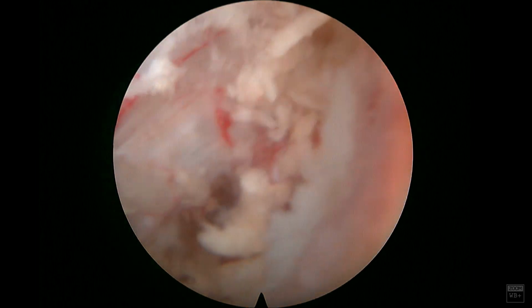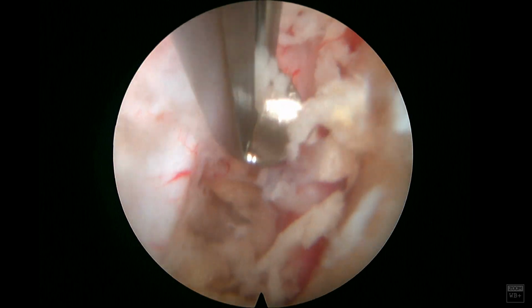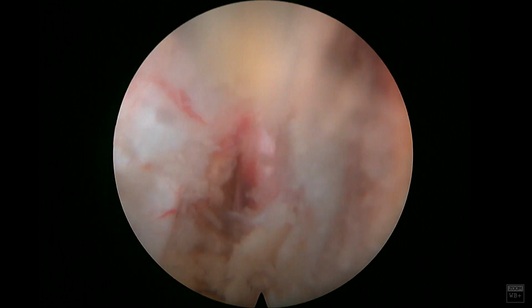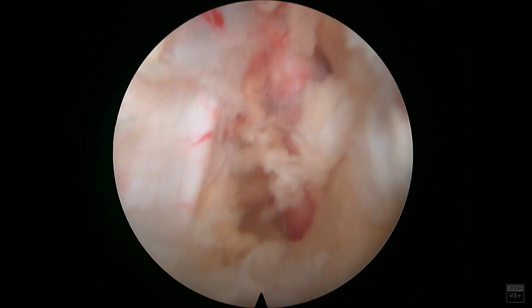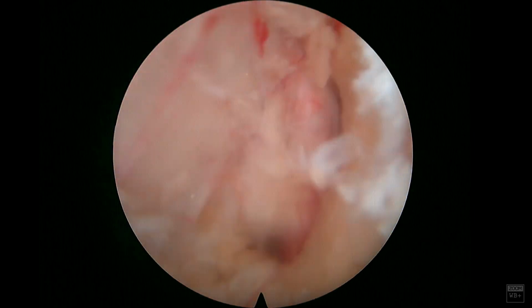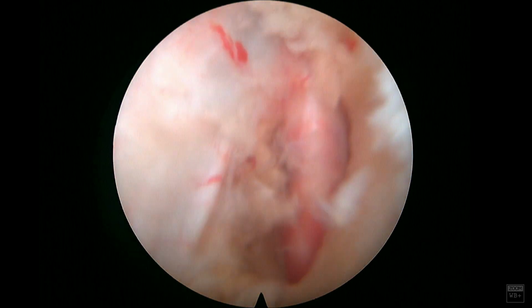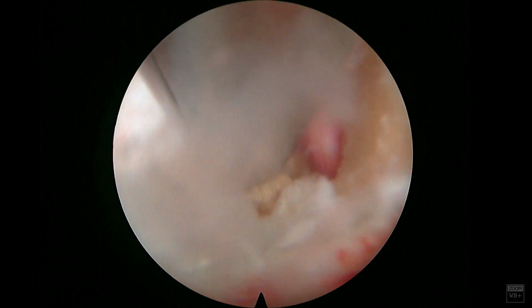Before I started to counsel patients on this, I'd always get phone calls about patients stating that they had numbness or still had some particular radicular pains that happened on and off, and they were somewhat worried about that. But they all typically subside after a couple of weeks. So that's a good thing to tell your patients. And so again, roughly about a 10 millimeter area of decompression here.